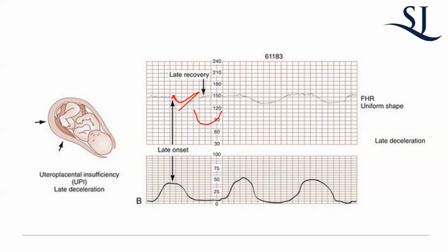Sometimes what'll happen is you'll have a fetal heart rate tracing with these really deep scoops and people say, oh, it looks like late decelerations, but they don't really do that. So that's not always true, but that's true most of the time. But late decelerations are the ones that you're concerned most about because that actually means there's uteroplacental insufficiency. It doesn't mean that the placenta is dying, but it means that for whatever reason, baby's being suboptimally oxygenated. Pretty much, baby's stressed, and it's real stress. Okay, so you have to do something about that.